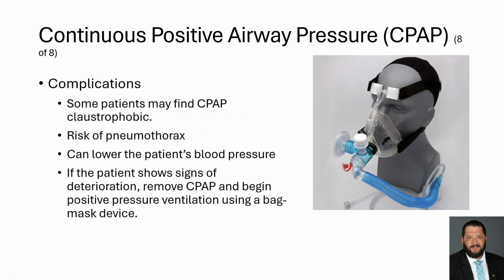Some complications may arise from CPAP. Oftentimes, patients who are experiencing respiratory distress can find the CPAP claustrophobic. This can increase anxiety and further deteriorate the respiratory status of the patient. You should try and coach the patient through any anxiety that they are experiencing. As the respiratory distress decreases, if this helps improve their respiratory status, the patients will often calm down, find a sense of relief, and embrace the treatment.